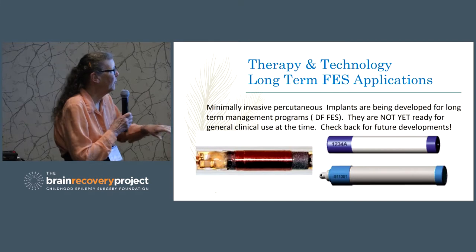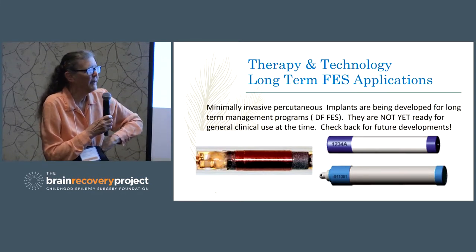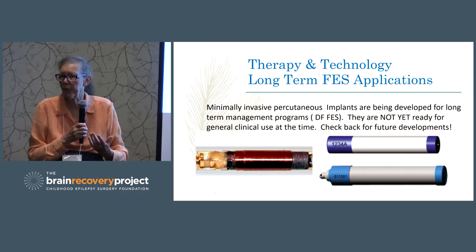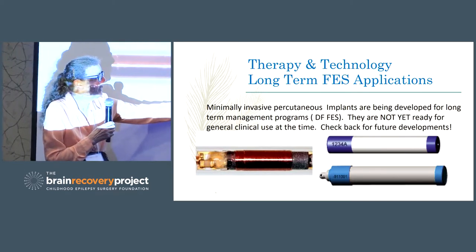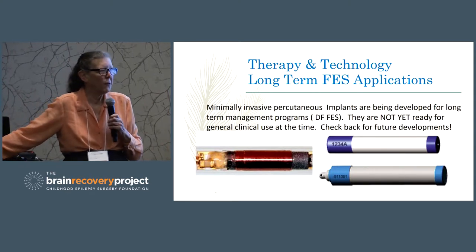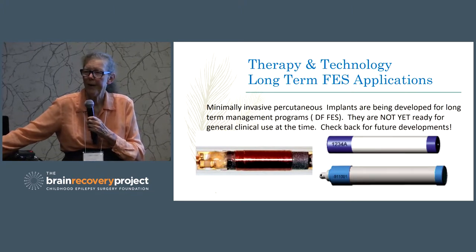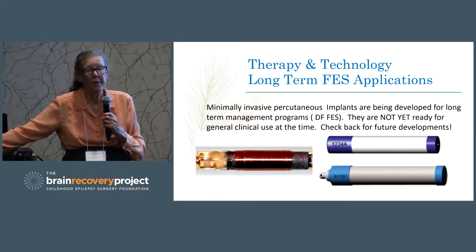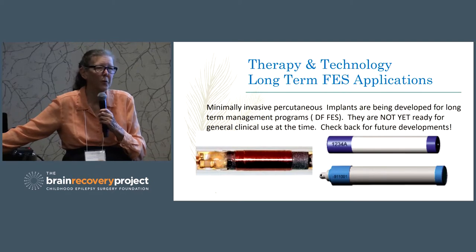These are two different stimulators. This stimulator is very, very small, and it fits in very, very well, but it doesn't have a power source. It can be trained, it can be taught to be turned on and off at certain spots, but it doesn't have an internal power source. This device is being developed, and it has a power source in it, so it's got a battery in it. So you charge the battery once or twice a week at night while everybody's sleeping, and it runs whenever you want to turn it on during the day. Okay, so it's pretty nifty. So those things are being evaluated by the FDA at the moment. They could be available within the next few years.